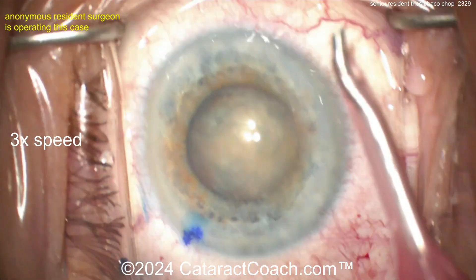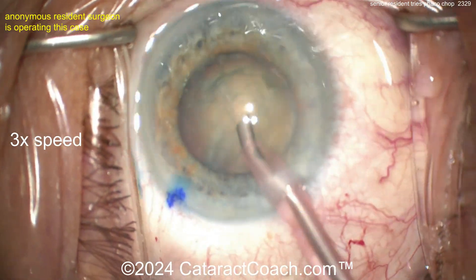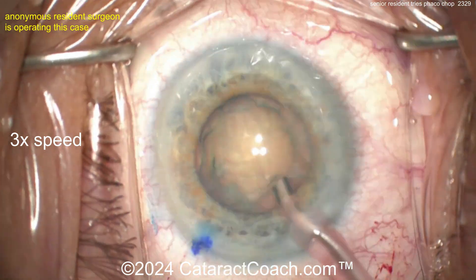I'm watching the video for the first time with you because I like to be surprised. Here comes the phaco probe going inside the eye, bevel up. Let's see what's going on — cleaning up some anterior lens cortical material.